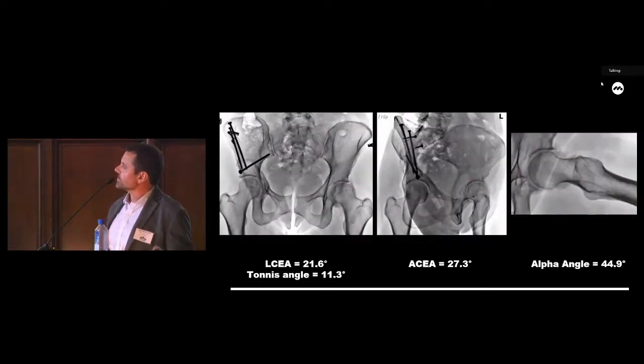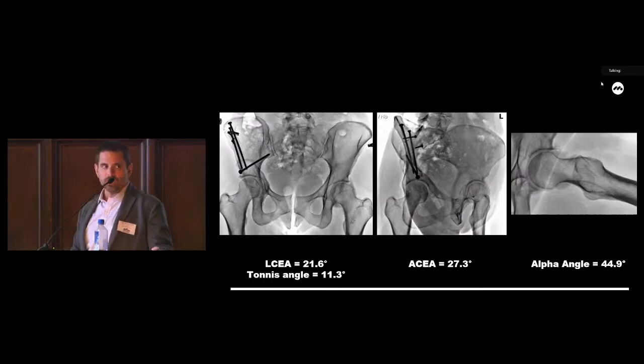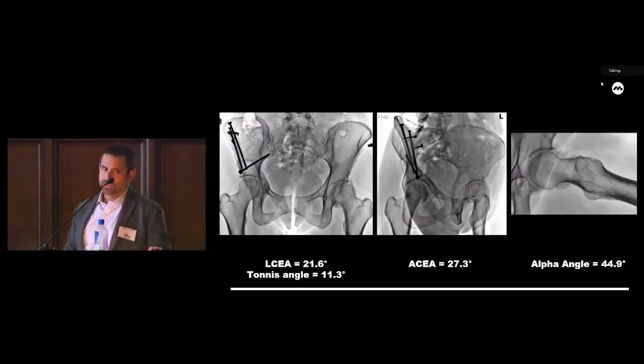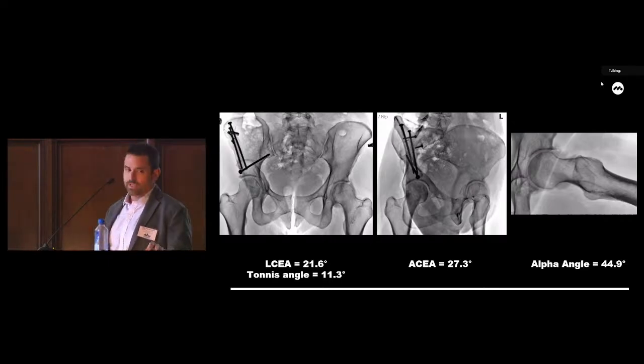These are radiographs. There's contrast still because right before coming up for x-rays and seeing me in the office, we did an MR arthrogram, which I generally avoid, but in the context of a previous arthroscopy, I generally get contrast because we don't have access to a 3T scanner. Her measurements are listed at the bottom.